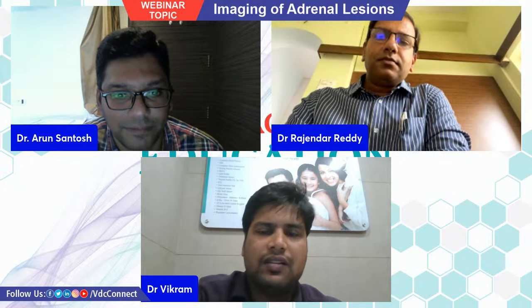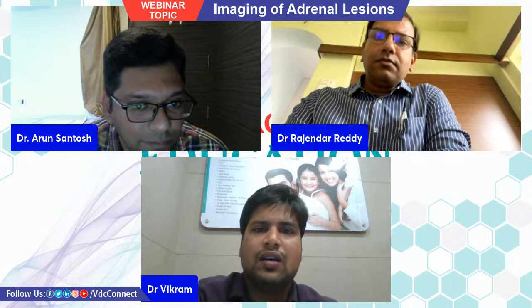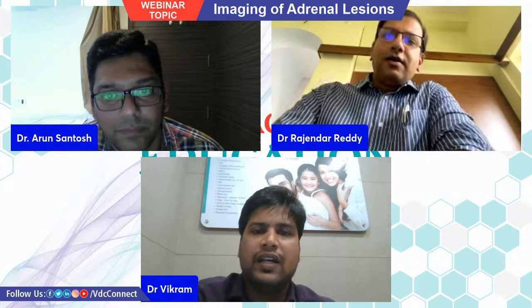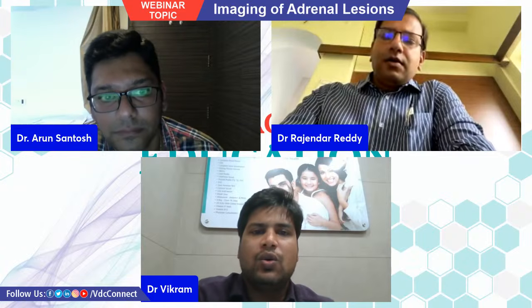Dr. Rajendra, I have a question for you. What is the role of biopsy in adrenal lesions? We come across a lot of indeterminate lesions. How do we go about it?